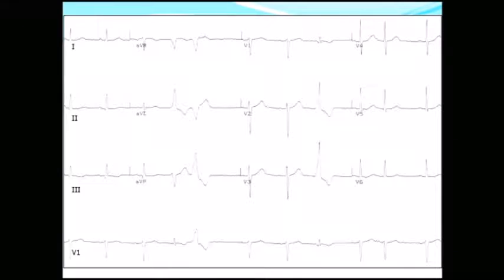All right. Who are we up to? Can you tell me what's wrong with this? Good. So which one's the ectopic? Are these both ectopics? Is this one the ectopic, or are they all ectopics? Okay. What does your gut tell you? Sorry? Okay. So they're all ectopics. Yeah. They look different from your normal QRS complexes. They're very wide. They just look weird. Okay. There's probably a classification criteria for what an ectopic is, but they just look weird. Yeah. So, yeah, weird.